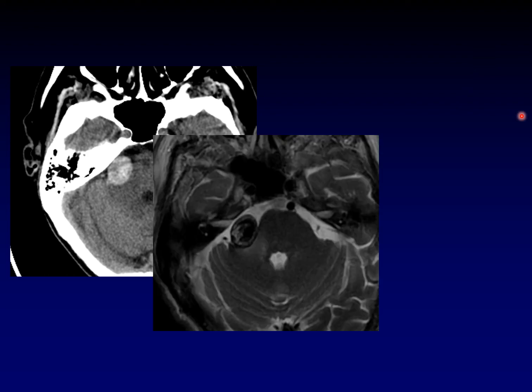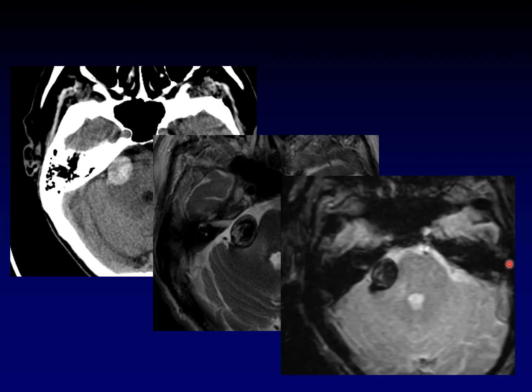Here it is on a T2-weighted sequence, very dark. For any of the things we're talking about, very dark, and maybe even a lamellar pattern around the outside, some heterogeneous signal centrally, and you can see that there's a lamellar pattern on the outside. Figured it out yet? How about a gradient sequence that shows this dark signal blossoming around the outside? This is clot, and what is the clot doing here?